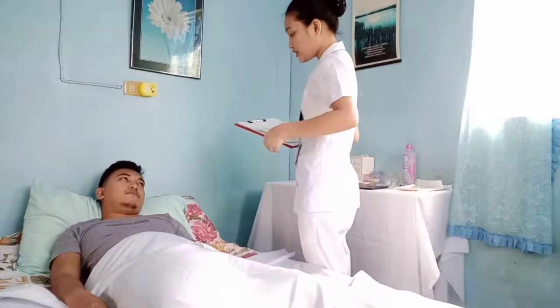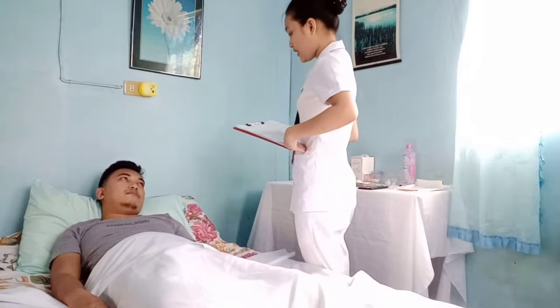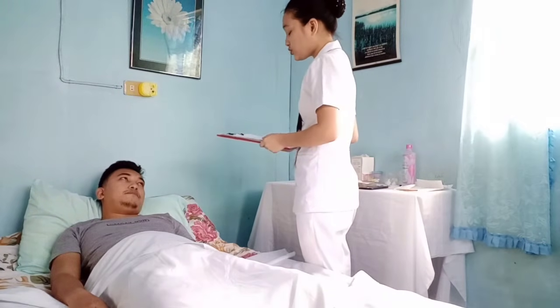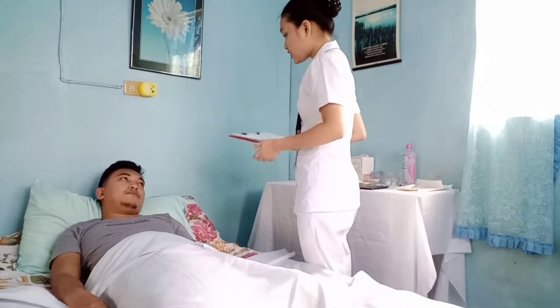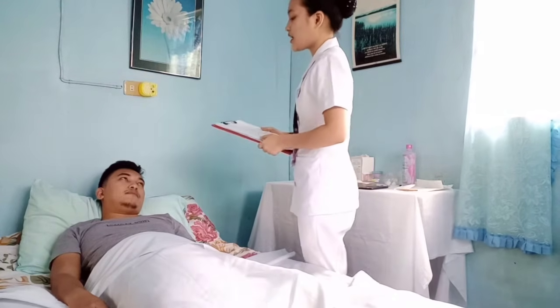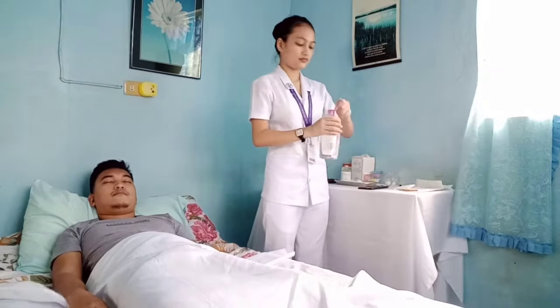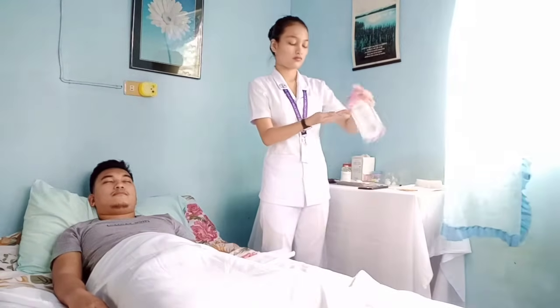Okay, so, sir, today I'll be doing a subcutaneous injection. I'll have to inject insulin in this part of your abdomen. Okay, insulin is to control your blood sugar since you have type 1 diabetes. Will that be alright? Yes. Okay, thank you. Perform hand hygiene and observe appropriate infection prevention procedures. Arrange the medication card on a hypodermic tray with the corresponding drug.